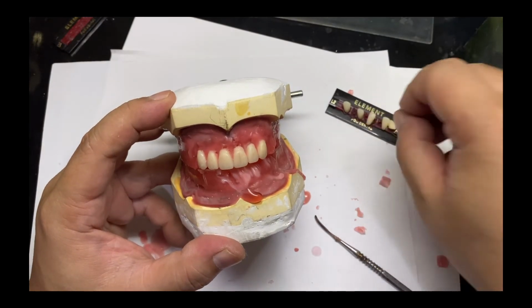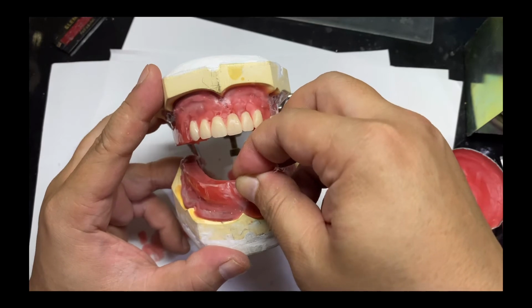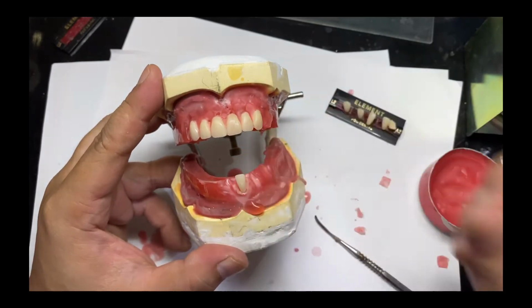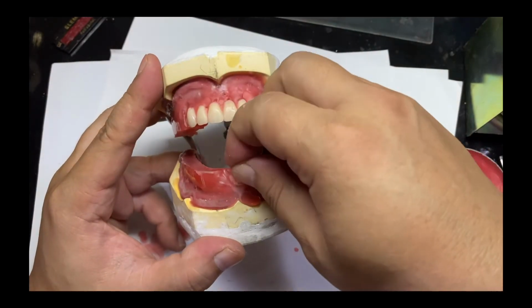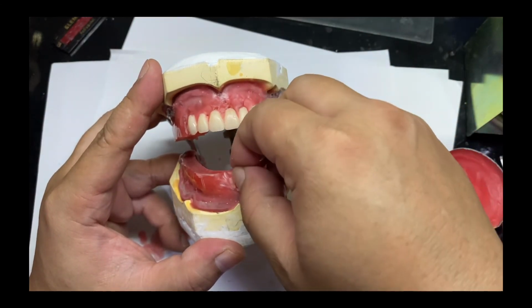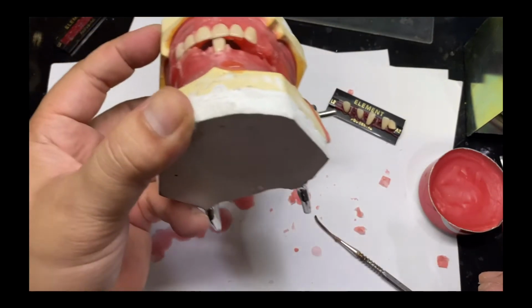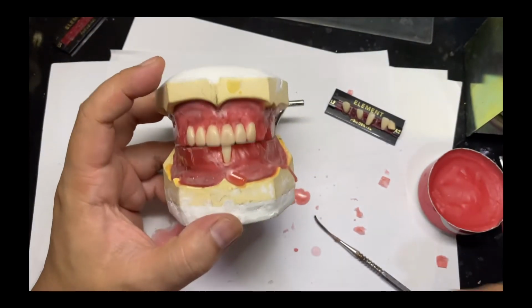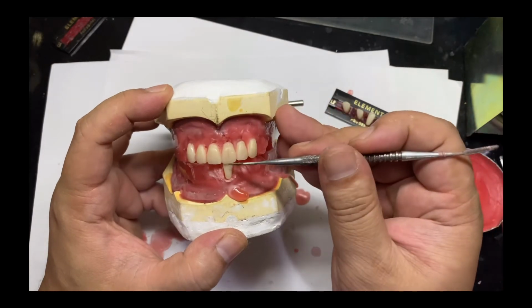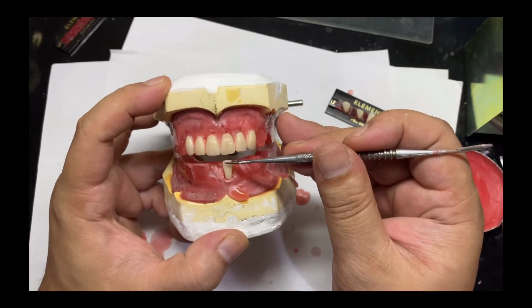First central incisor, you just have to position it here and then check the midline and overjet relationship. And then check the incisors, check the midline and the overbite. It should be at least 1 to 2 millimeters only.